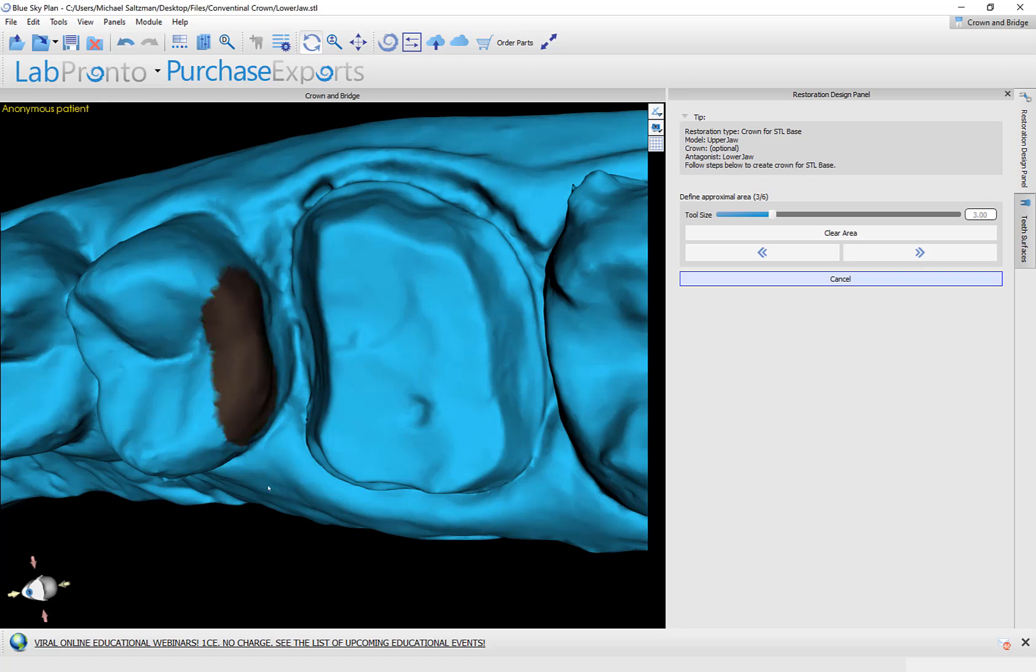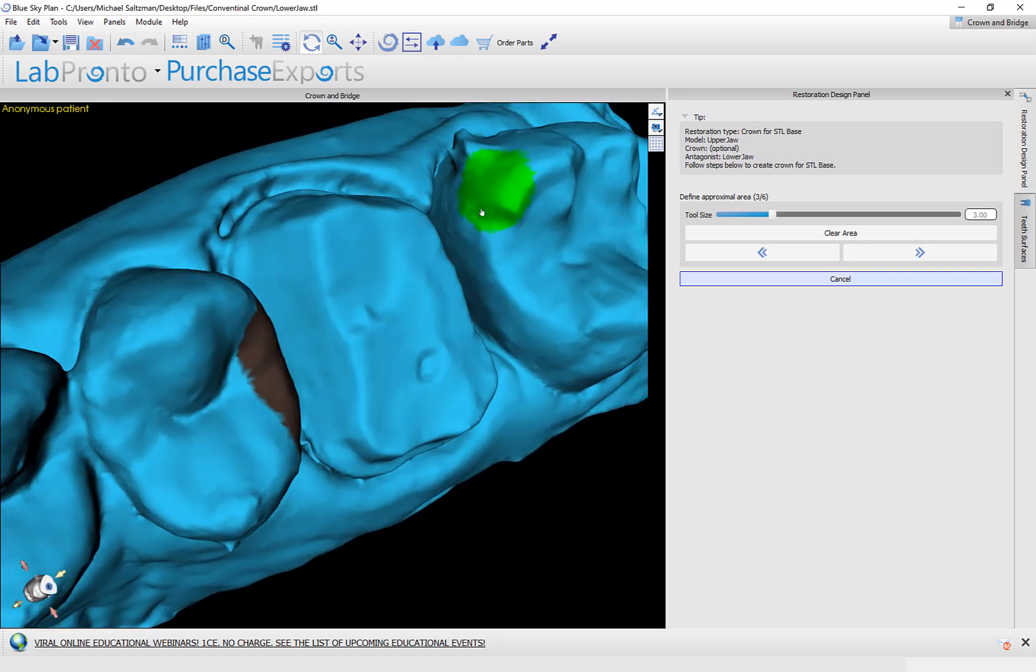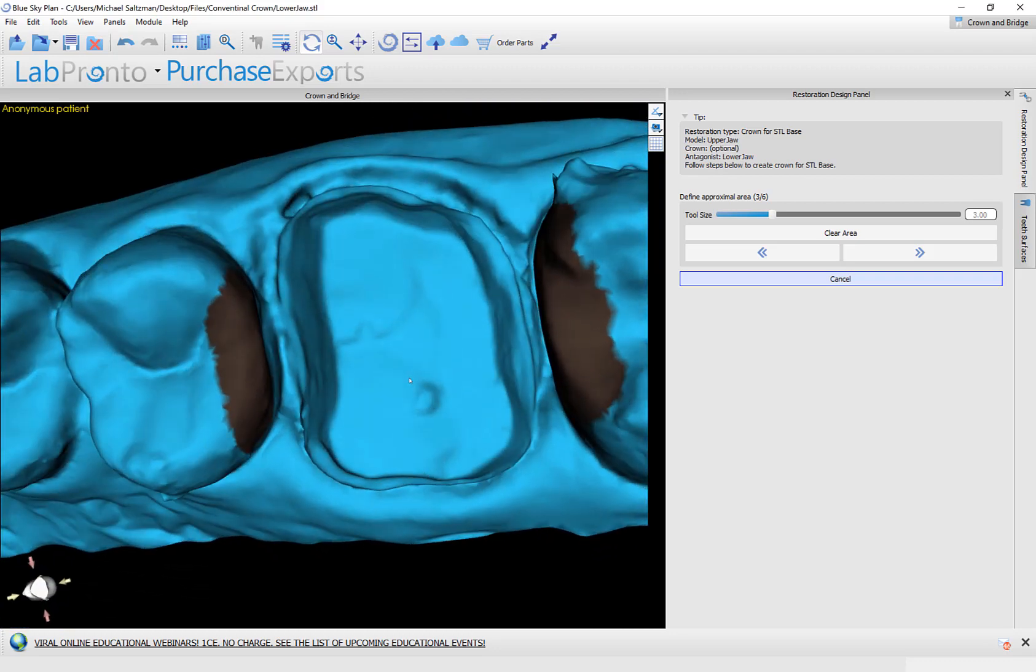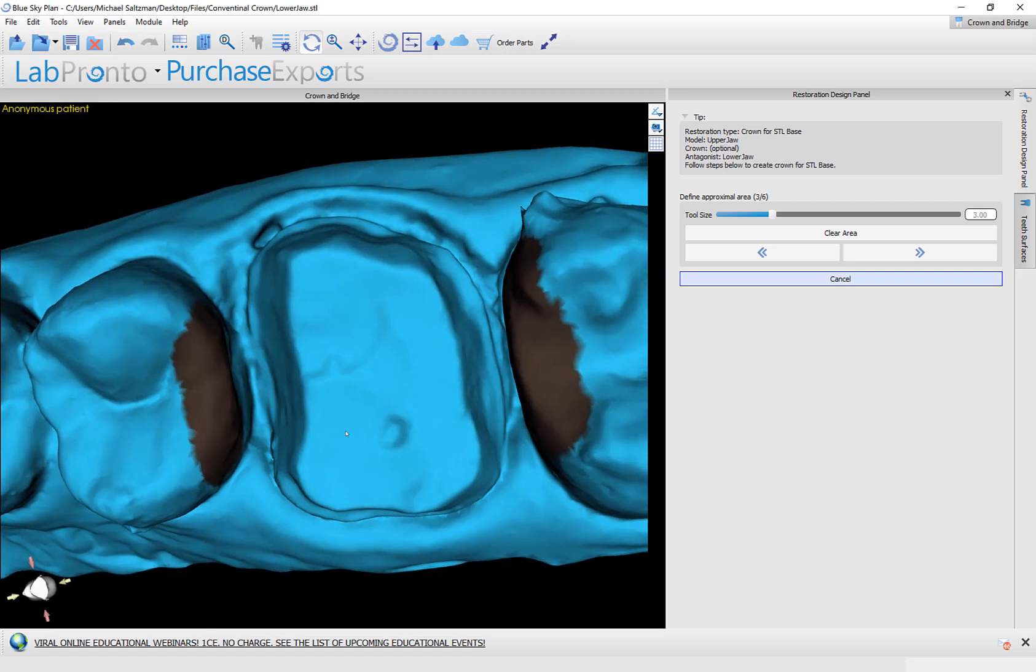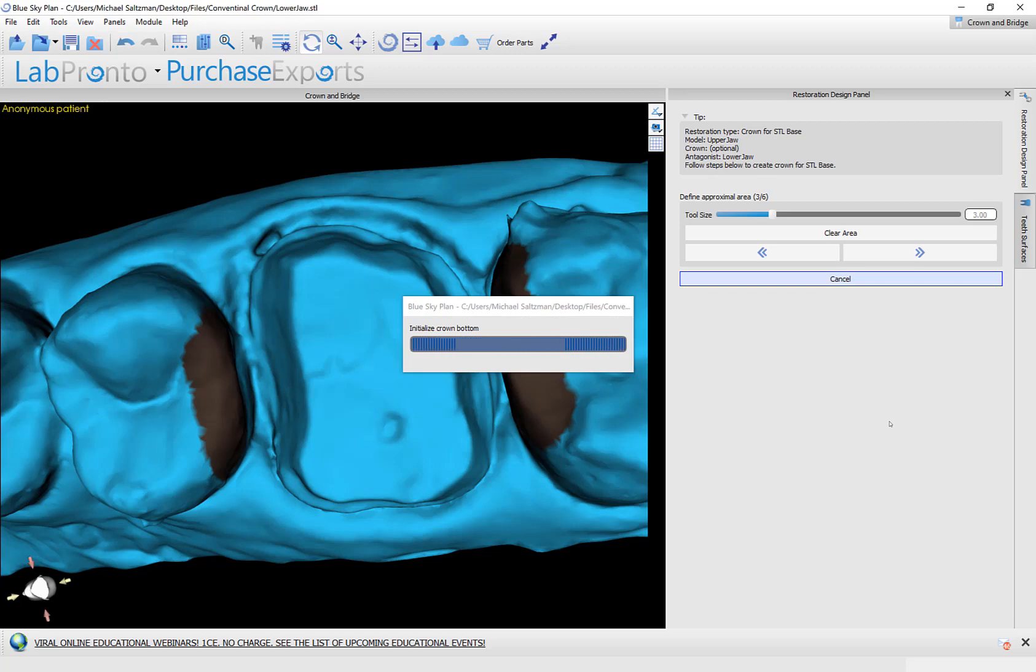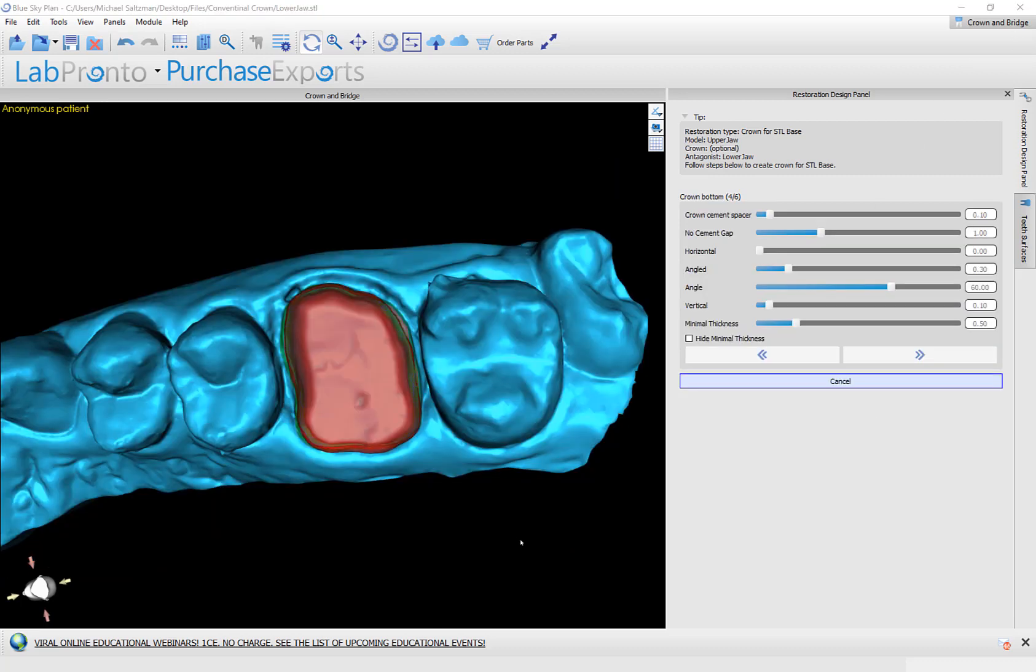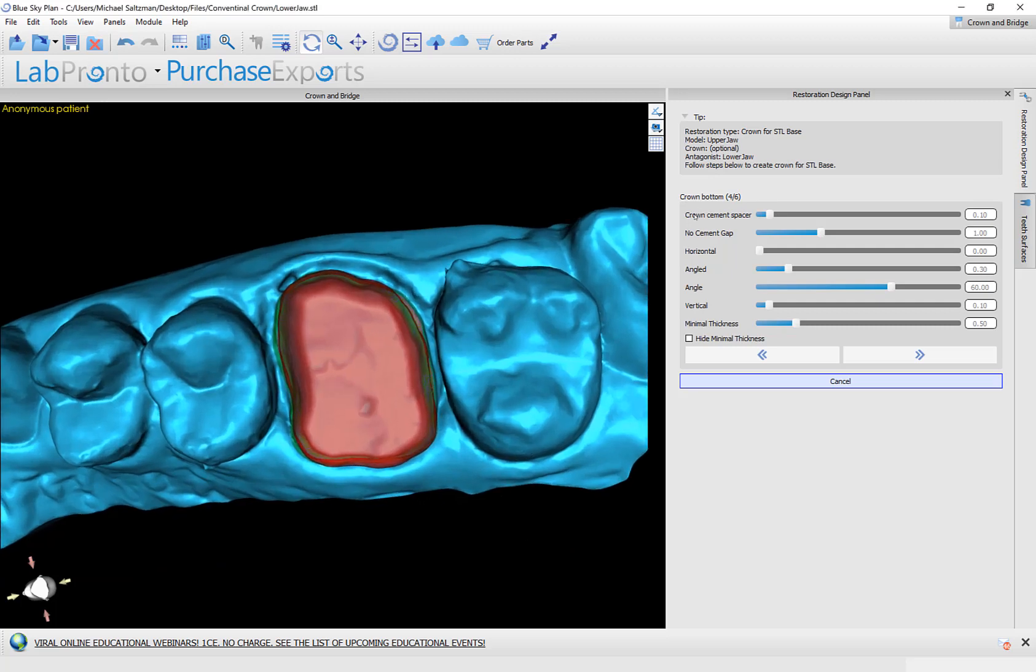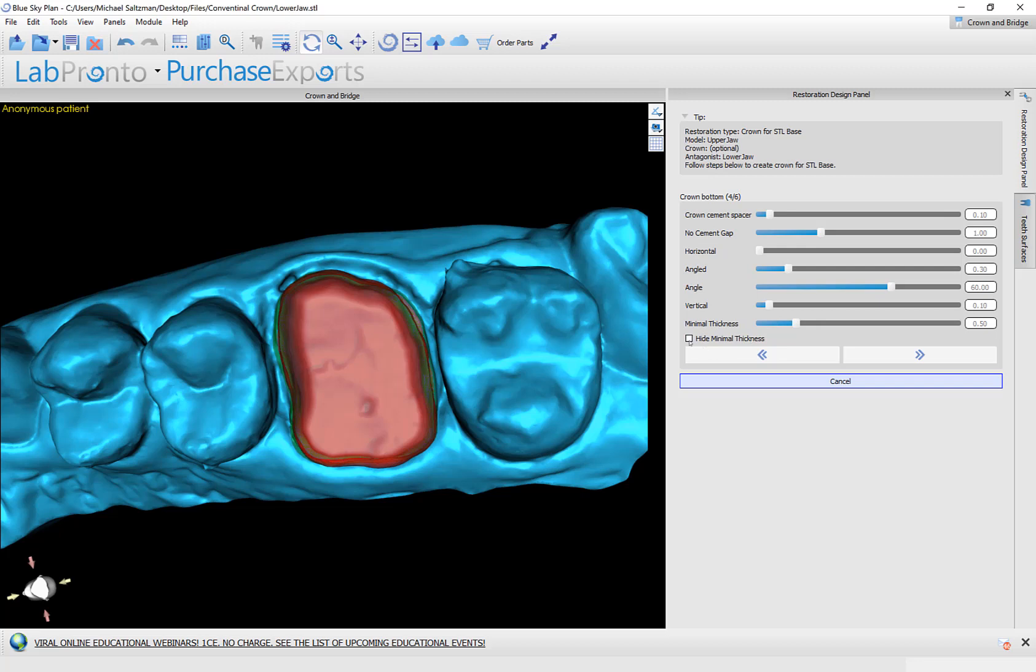Hold down the shift key and drag with your left mouse button to mark the adjacent teeth. If you are missing an adjacent tooth, then just mark the tooth that does exist. We now have a series of sliders to edit the crown bottom. The crown cement spacer is the distance or the offset between the bottom of the crown and the model underneath. No cement gap is the height of the crown where there is no spacer or offset. So right now the bottom millimeter of the base of the crown has zero separation between the model and the bottom of the crown. And then we have different sliders to edit and change the base of the crown. We have a minimal thickness slider on the bottom and the option to hide minimal thickness. If the minimal thickness is violated and we check the checkbox, then we will not see the minimal thickness. At this point, I'm going to keep the defaults as they are and go ahead and click on next.